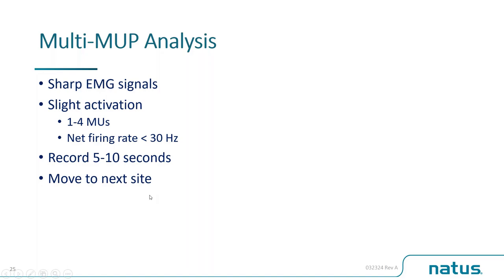I think the modern instruments will save the signals. It's not necessary to sit there and analyze the epoch immediately. In the interest of patient comfort, record a signal, move on to the next site, and then repeat the process.